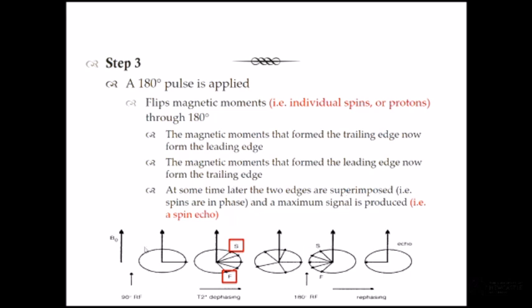So let's just look at this figure down here. External magnetic field, 90-degree pulse. We now flip our magnetisation into the transverse plane, it's in phase coherence. Immediately we will see dephasing. So we have slow and fast, and they're going through this dephasing due to T2 star effects.